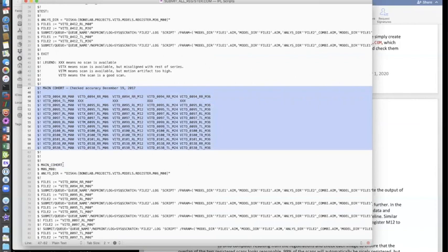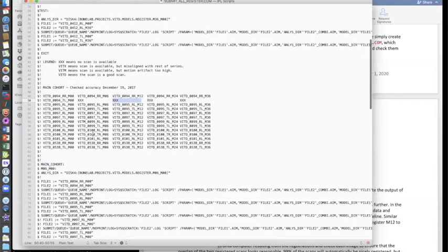Here, what I did is I just showed, for my own reference, when I had a time series of data, this used to be a lot longer because it's only showing 3 or 4 subjects from the study. But sometimes a study subject didn't come back, or we lost a data set, or something happened, or I discover there's too much motion artifact and I want to exclude it. I use this as a table just to remind myself what was excluded. If I changed the letter to VT-VIT-M, I knew it was a motion artifact challenge, so I would exclude that out of the registration. I wouldn't even do the registration with it.